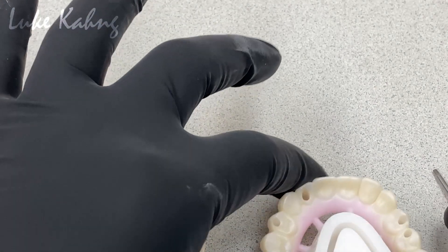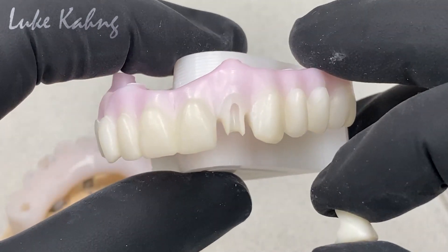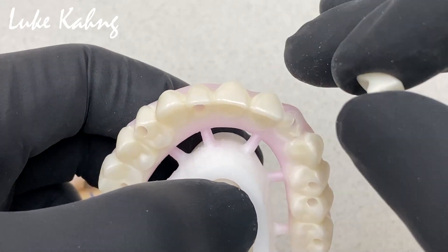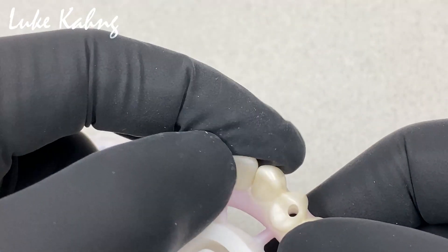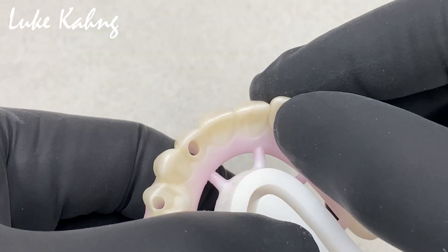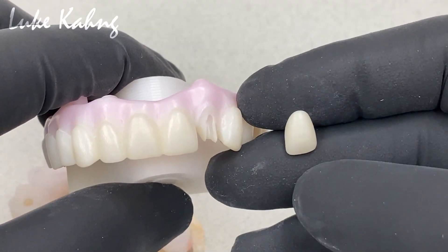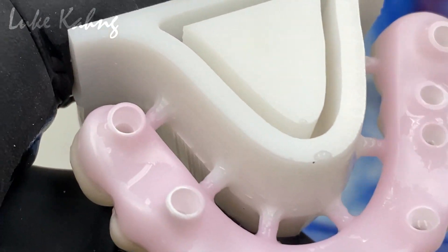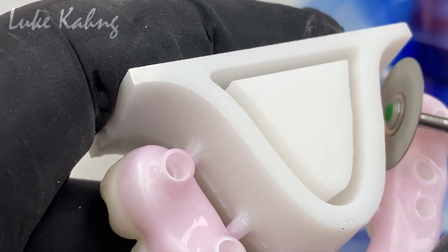After we design it, we made two pieces — we save this, as you can see, and we made the monolithic top of that. So we're going to make the two-piece with the monolithic on top, and the doctor can put the temporary cement for those. Now I'm going to cut it as we designed it.